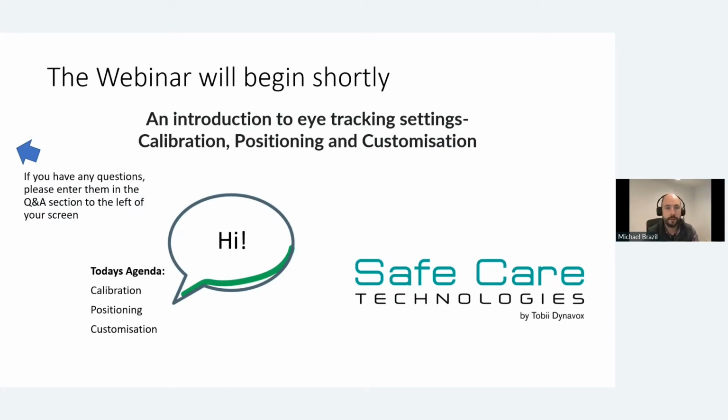So today's webinar, we are going to talk about eye tracking settings, the software from Tobii Dynavox. We're going to go through an introduction. We're going to talk about the calibration, the positioning, and the customization.